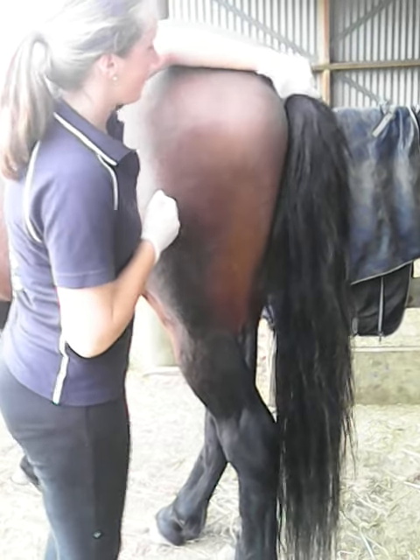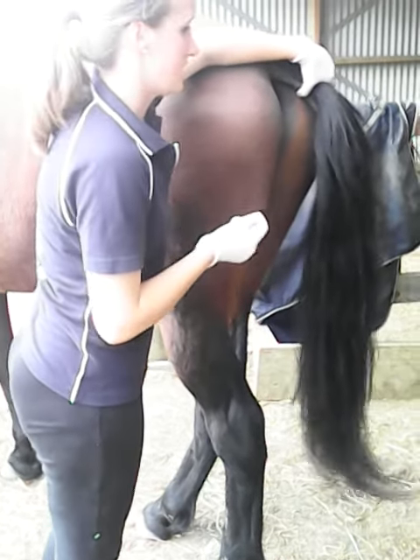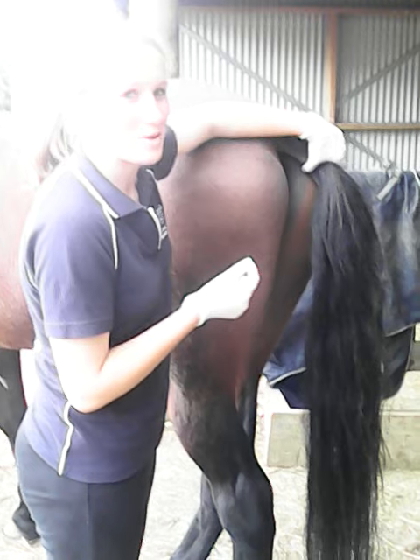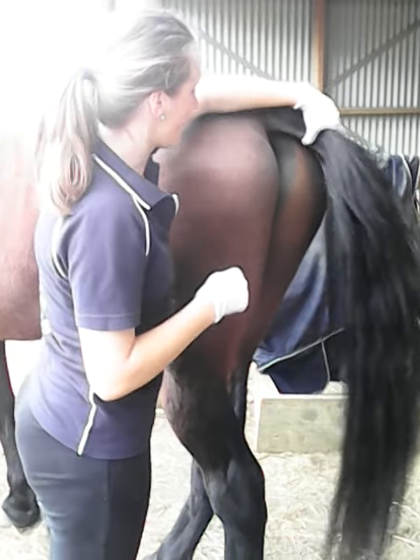Then push the tail away from yourself. With the thermometer, make sure it is lubricated, and if it is a mercury thermometer, make sure it is down — shake it down with quick shakes.